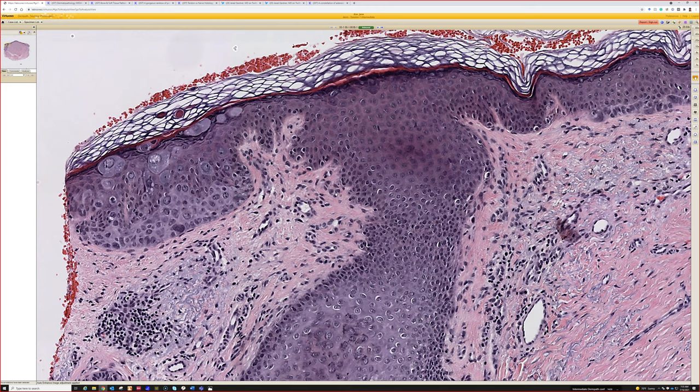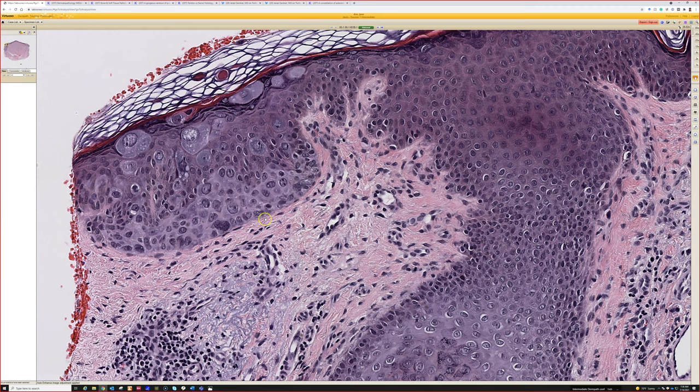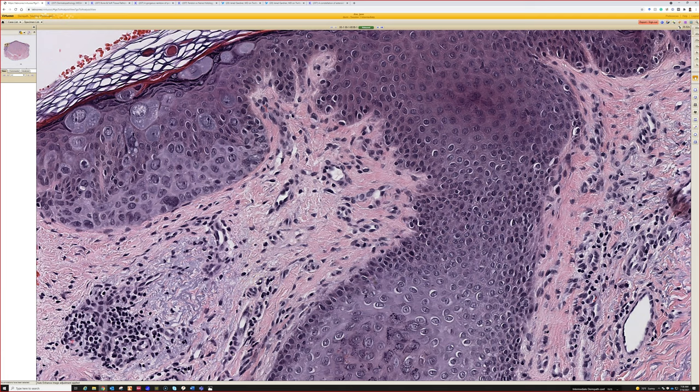Paget's gets a little bit of a bluish color, but it's subtle and a little different — it's lighter, not this deep blue-gray. Number two, Paget's usually will not be occurring in sun-damaged skin. It's usually going to be anogenital or nipple. It's very, very rare to have true Paget's — adenocarcinoma cells in the epidermis — in a chronic sun-exposed site. And here we've got solar elastosis.